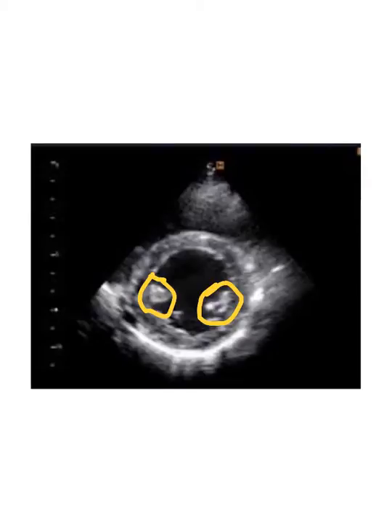The papillary muscle level is the best way to show that you're at the right level to evaluate function. You go too deep, then you're near the apex, and that's not always great, especially if they've had an apical heart attack or MI, then it's not going to work so well. So try to stay at the papillary muscle level.